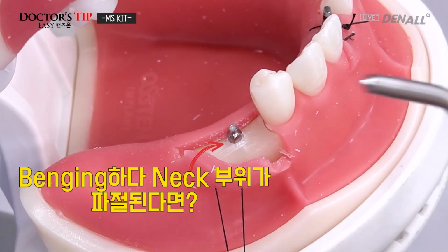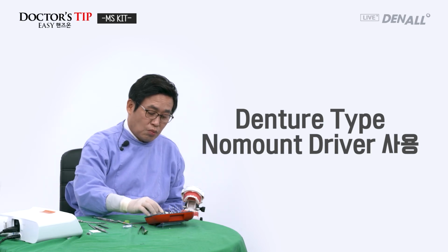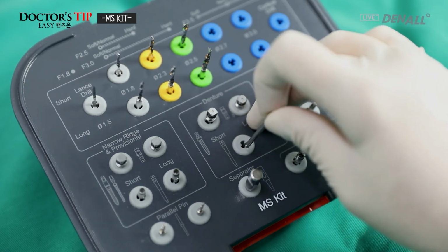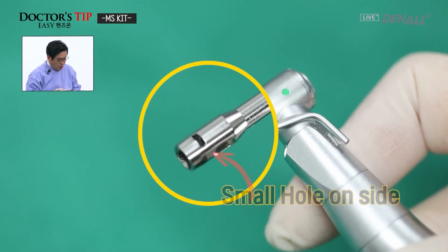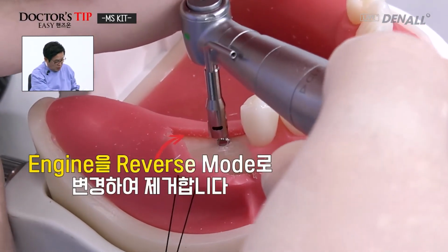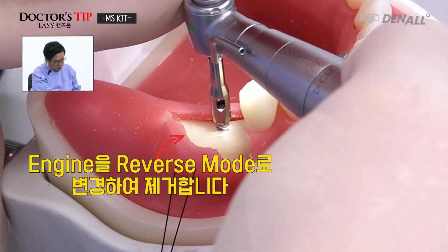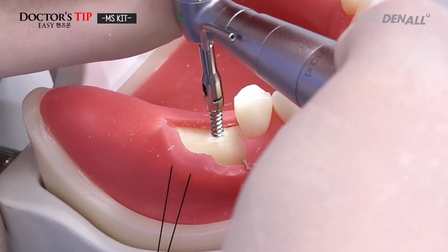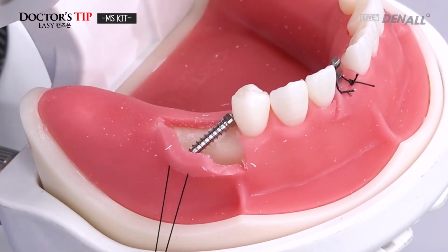But if bending results in such fracture, then denture type fixture driver, you have the no mount driver. Then for denture, you can use this. You connect, and you have hexagonal nut on the provisional bottom side. So you push this in the reverse mode, then it can be easily removed. So while using provisional, if there is a fracture, then using this denture type, you can easily remove the fixture.